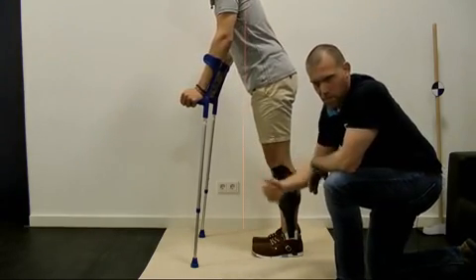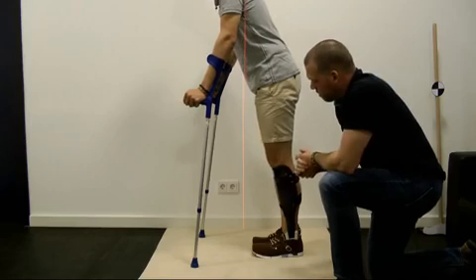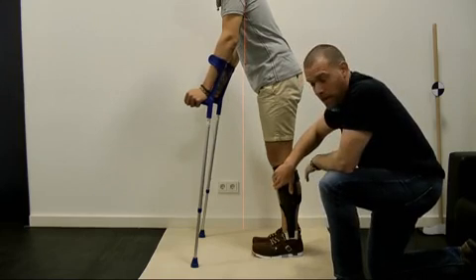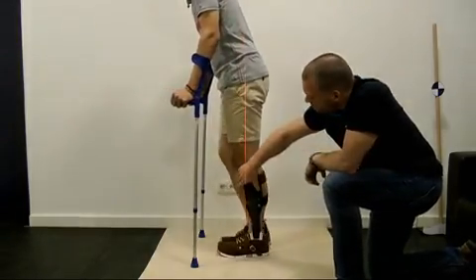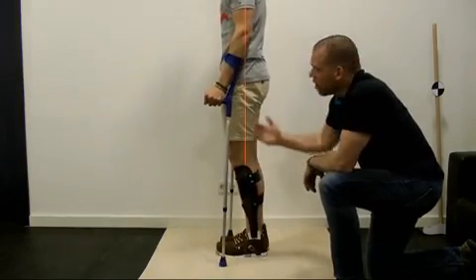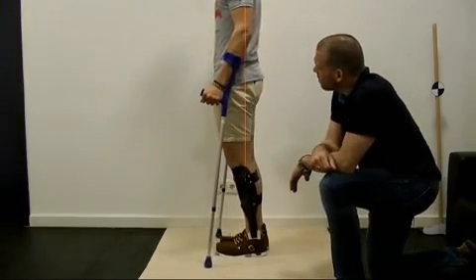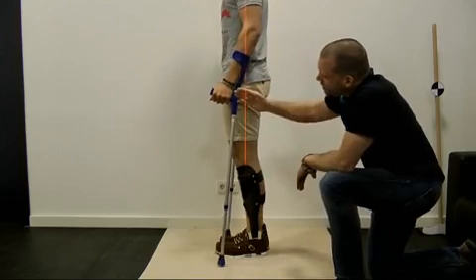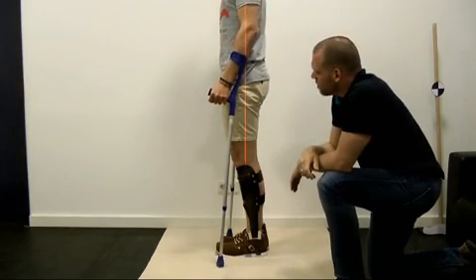Of course, we would have to recognize that some patients stand in this position habitually, and then it would make sense to encourage them to rely more on the orthosis and to feel the support that's given to them through the ventral shield. They can lean against the ventral shield and bring the forearm crutches closer to straighten up the upper body. We should check if it is possible for them to assume a more physiological position and to take the load from the crutches and, of course, from the wrists and the shoulder joints. What we are trying to achieve is a more physiological posture that could provide more stability and balance and improve the walking ability of the patient.